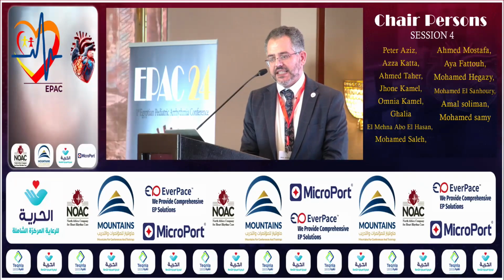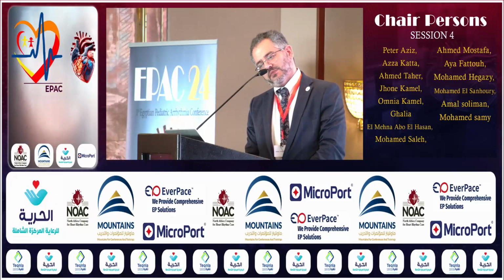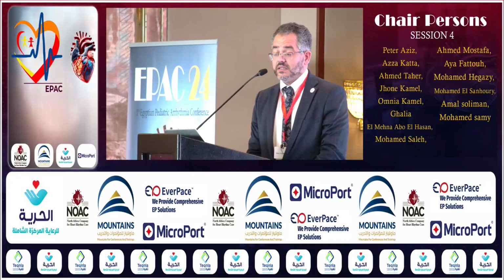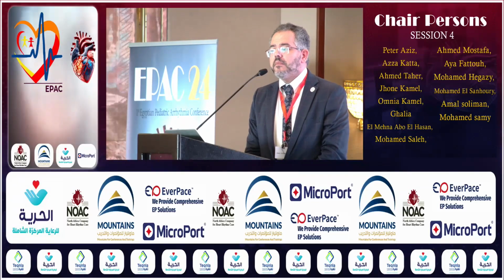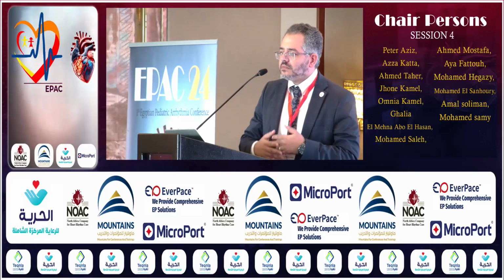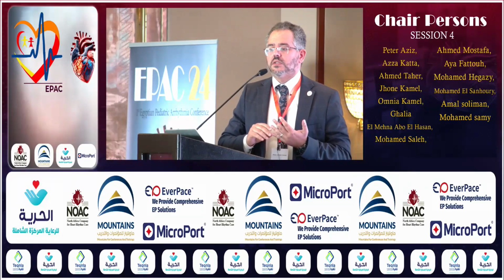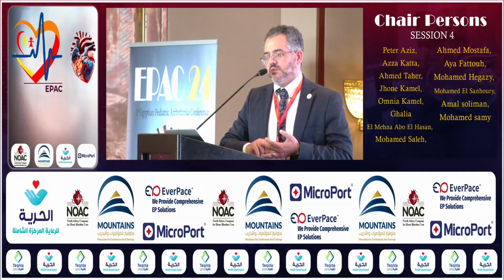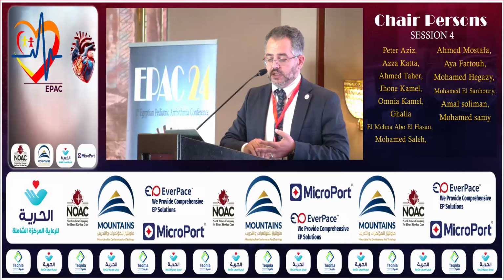Availability recently, it's not that available. It is still more expensive than RF. I mean, it is that good. The thing is that we've been using RF for a very long time. We've got significantly better with radiofrequency. We've known where the problems come from, and we've got better and better in avoiding them.